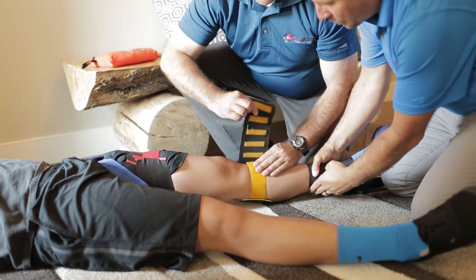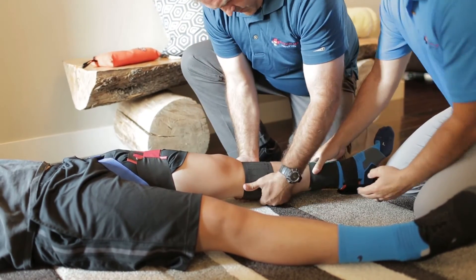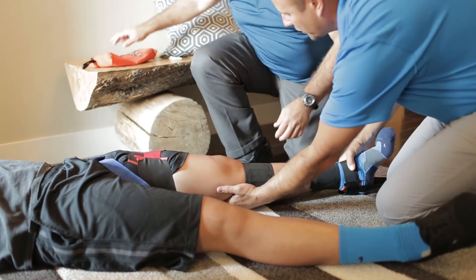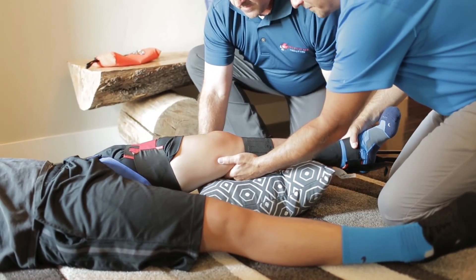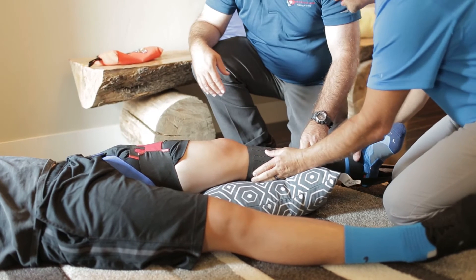Now I've taken the place of the traction, and then it's a good idea to put some sort of a pillow underneath the knee for that little bit of bend that's left in the knee. At this point, your patient's pain level is going to go from an 8 or 10 down to a 1 or 2 because we've relieved that spasm on the muscle.